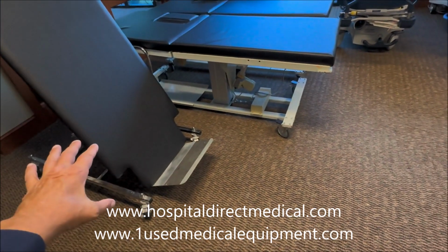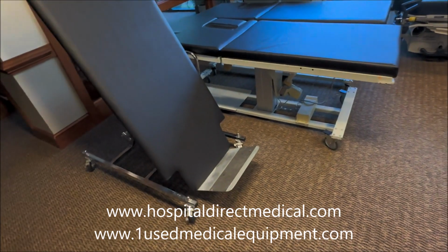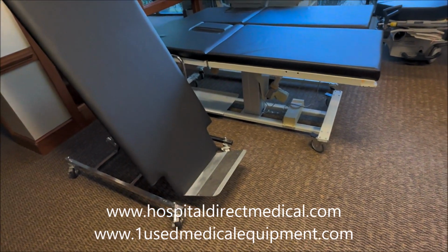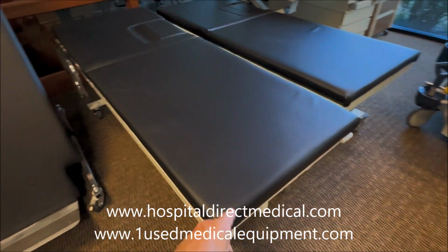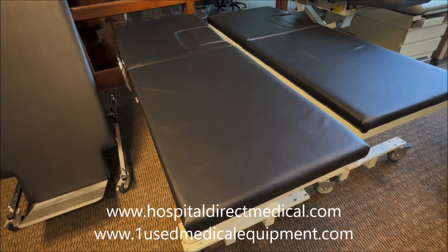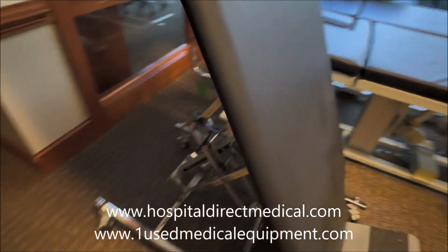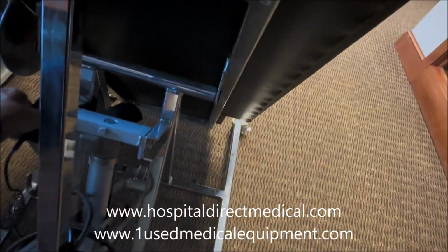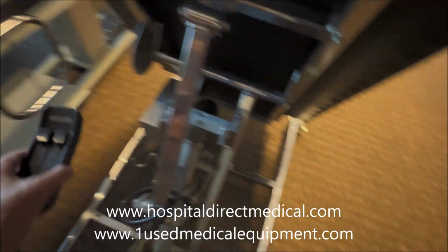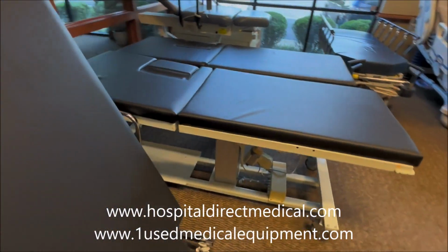Even if the table was flat, you would immediately know that it's a vascular table because they're obviously going to put somebody at an angle. They need to keep them on there. Whereas these two tables right here, being cardiac tables, will not have that functionality. And the number one thing that I do, or have staff do, is get the remote control, and you'll see on a vascular table that you're going to have the Trendelenburg features.